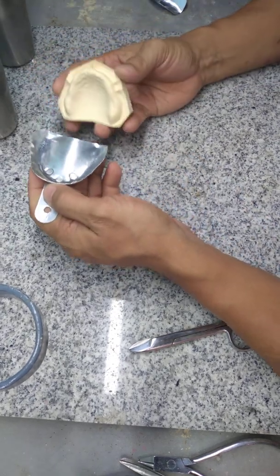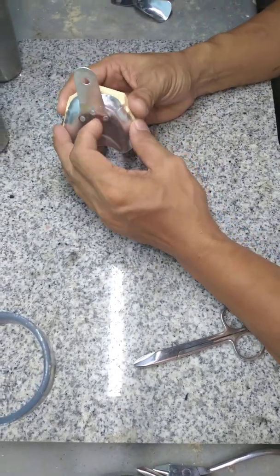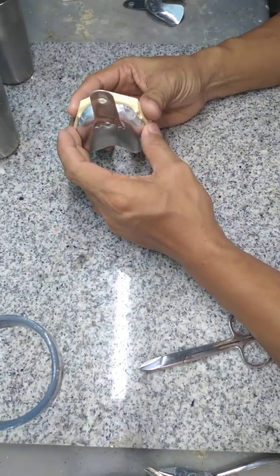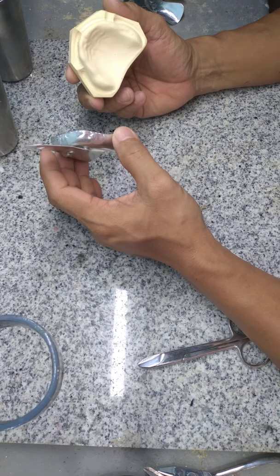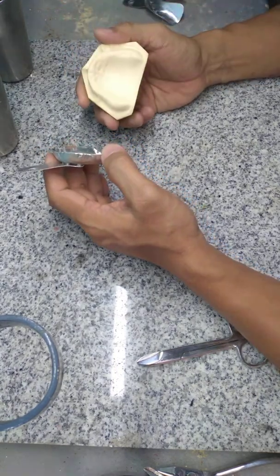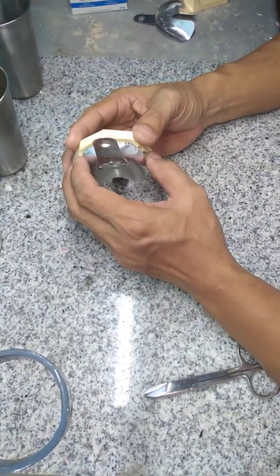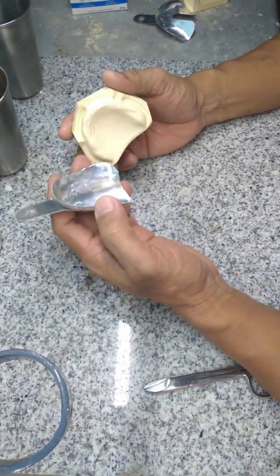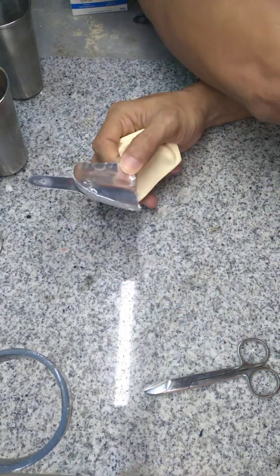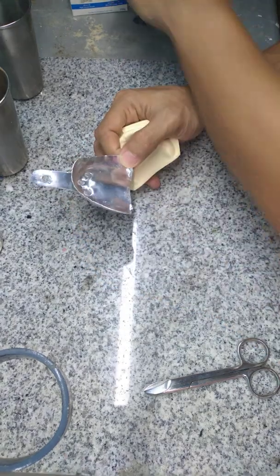The idea is to make your tray bigger than your cast — bigger than what fits your patient. At least 4 mm bigger, so you can have room for your modeling compound later on.